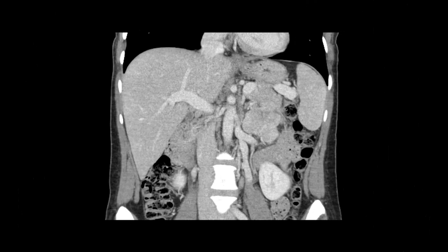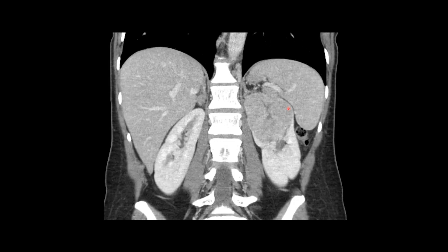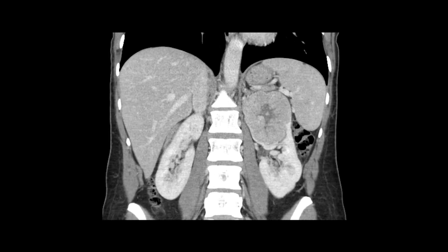Now we're jumping ahead to the nephrographic phase — also coronal reformatted images. This phase occurs about 90 to 100 seconds after contrast administration. The renal parenchyma is now diffusely enhancing, the renal pyramids have filled in, and the mass remains enhancing. We can see very clearly that claw of renal tissue surrounding the mass, confirming this is a renal tumor and not an adrenal, splenic, or retroperitoneal mass.